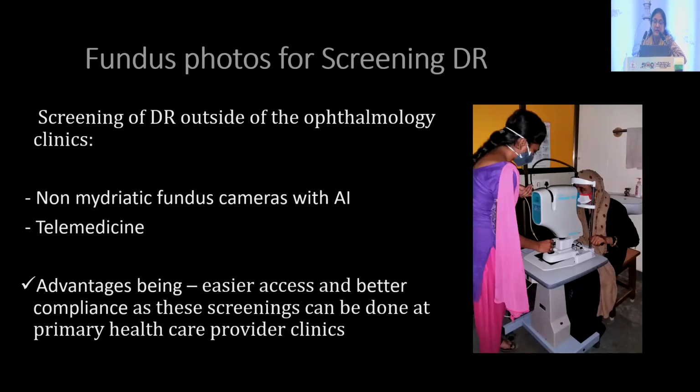Screening for DR outside the ophthalmic clinics is always a challenge, and I think Dr. Kim really spoke about it. What we are now targeting is that we should not only limit the screening of DR to ophthalmic clinics, but also target the physicians and the diabetologists. This can be very well done using non-mydriatic fundus cameras with AI and also using telemedicine. The advantage is easier access and better compliance, as these screenings can be done at primary healthcare provider clinics themselves.